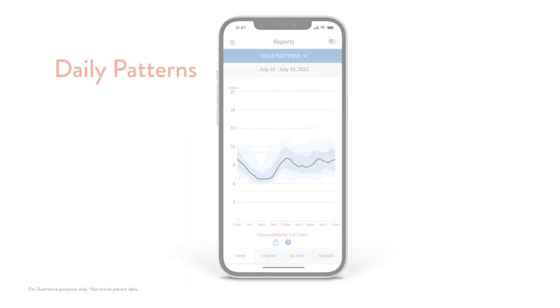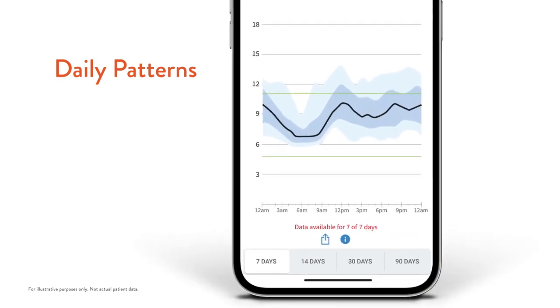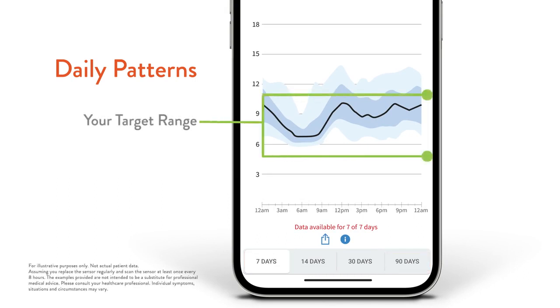The daily patterns report shows you a summary of your glucose on a typical day. Your sensor is reading your glucose every minute — that's a lot of information. This report helps summarize information on one simple graph. You can choose how the information is summarized by selecting 7, 14, 30, or 90 days. The green horizontal band is your set glucose target range. Check to see if there are times of the day when your glucose results are below or above your target.